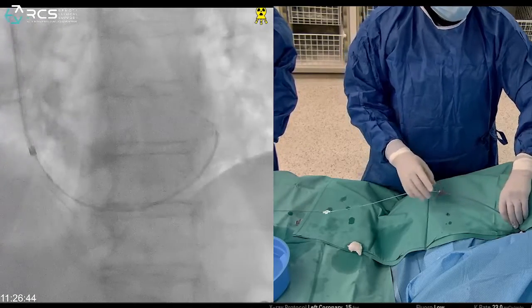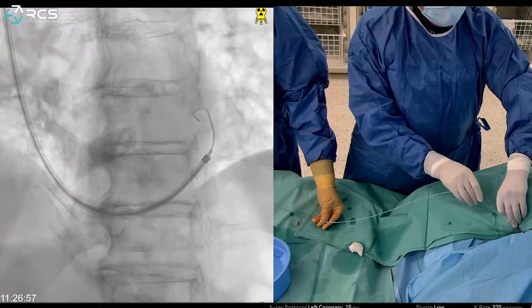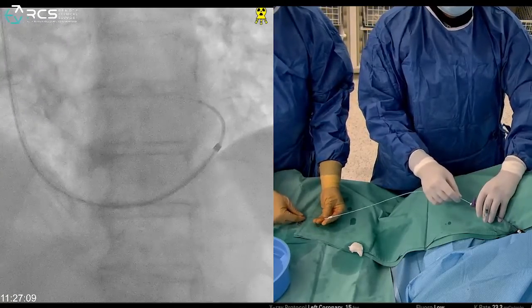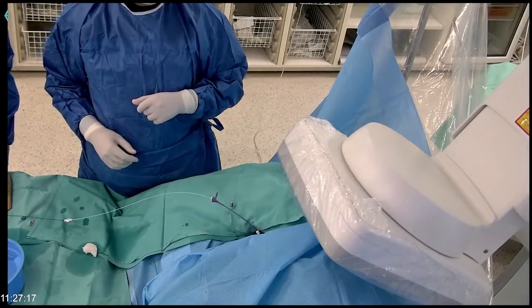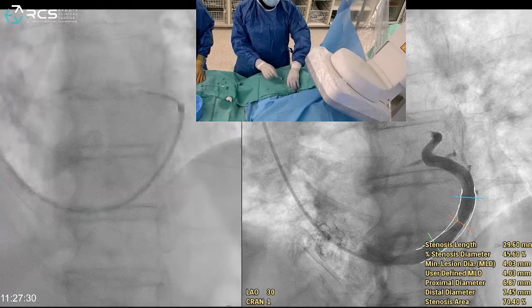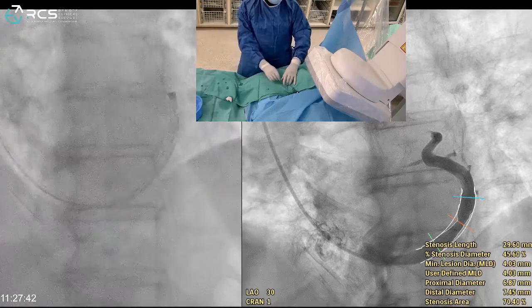I advance into the great cardiac vein. Sammy holds the multi-purpose and wire while I advance the guiding catheter as far as I want to implant. Looking at the original angio — good. The guiding is now distal to where I want to implant. Sammy takes out the multi-purpose and we are left with the wire and guiding distal to the implant site.